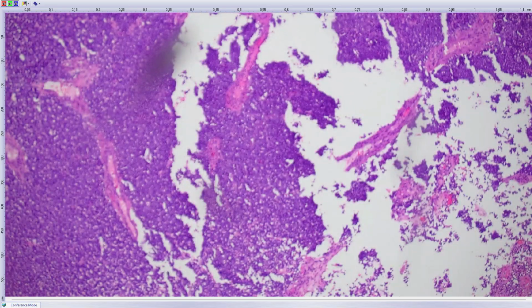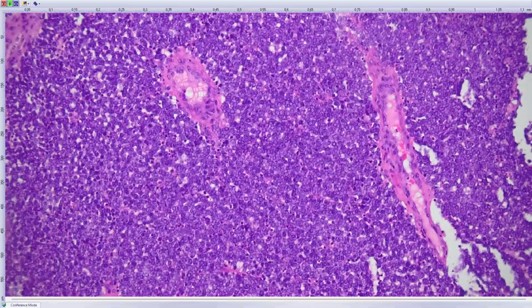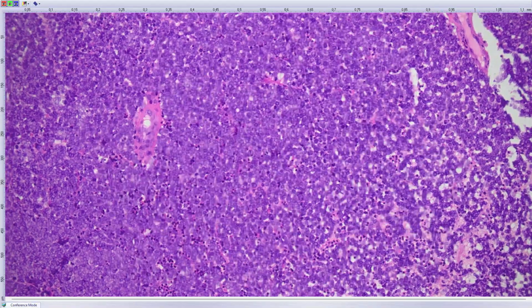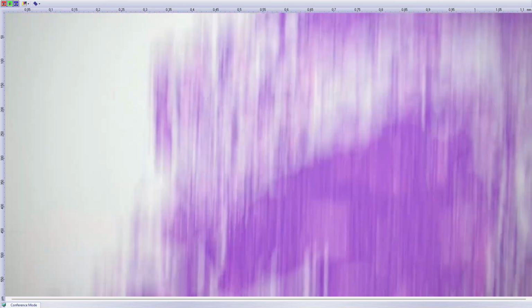And now if we look back at the morphology, I think with this immunoprofile, cytokeratins, INSM1, we should already be focusing purely on neuroendocrine carcinomas. And now it's only about, is it primary or is it metastasis from, I don't know, pancreas or lung? So this is Merkel cell polyomavirus immunohistochemistry, which basically can highlight the Merkel cell polyomavirus infection if it's there.